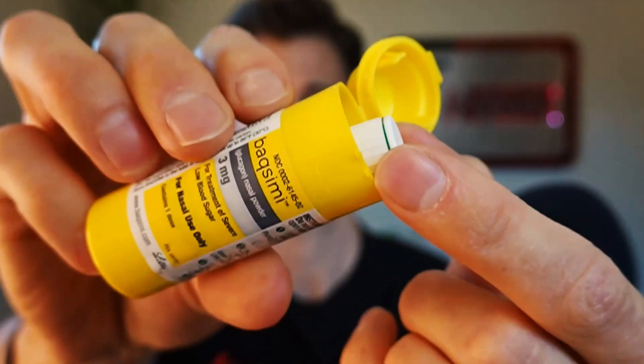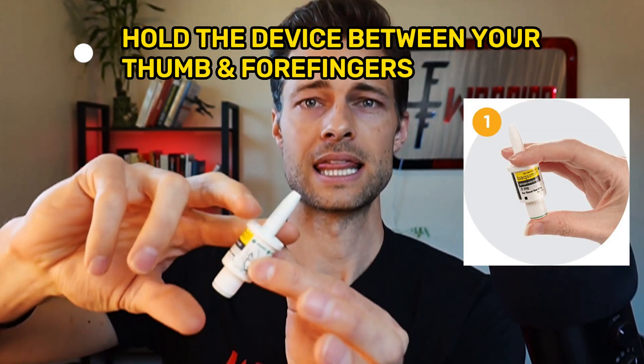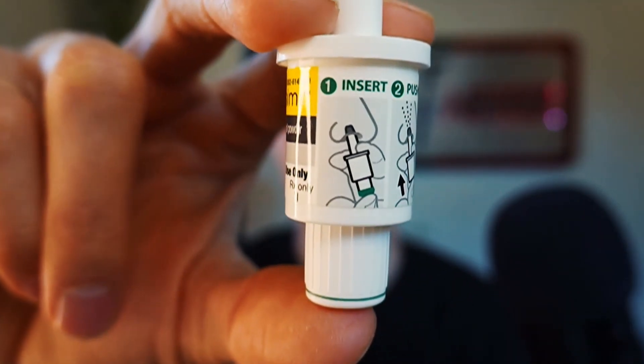Next, open the lid and remove the device. It says do not press the plunger until you're ready to give the dose. There is our device — that's where it goes in the nose. The device itself also has instructions printed on it, which is really nice. It says: insert into the nose and push the plunger all the way in until the green line disappears.